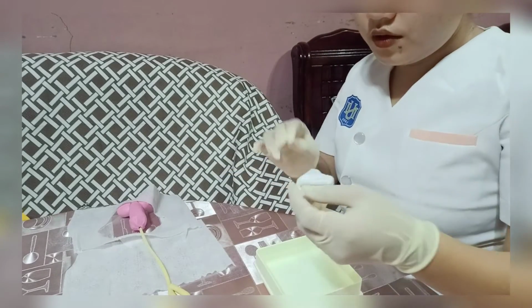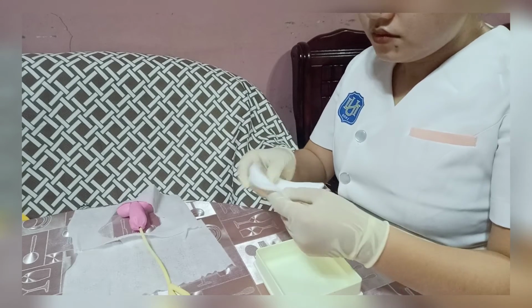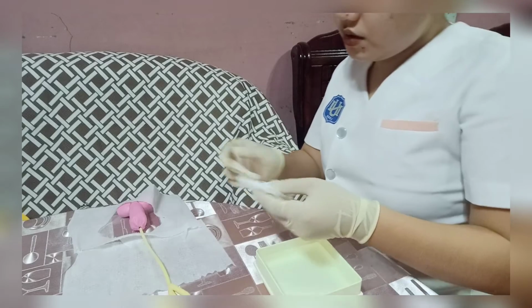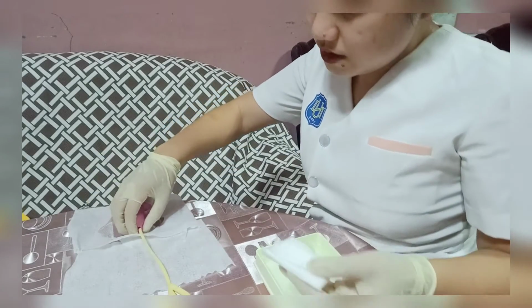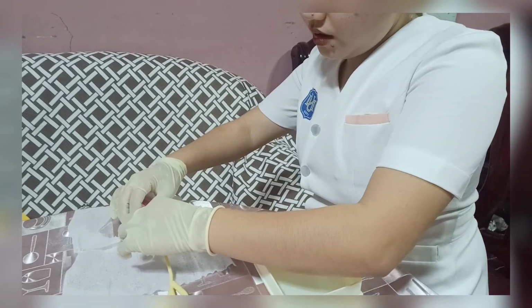Get a washcloth and begin to hold the catheter 4 inches away from the meatus.